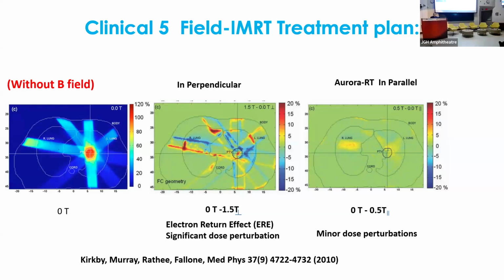In the parallel, the one to the right, you notice the difference is very small. It's only minor dose perturbation. It only occurs in the lung and air, very small. Now you know why we like the parallel.